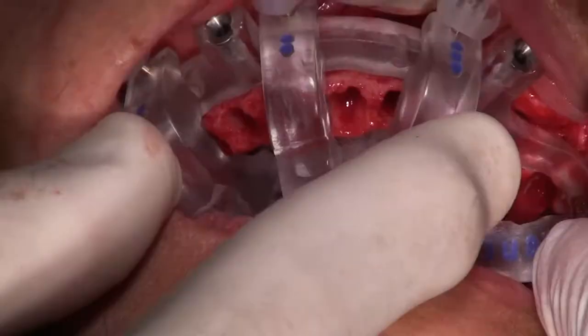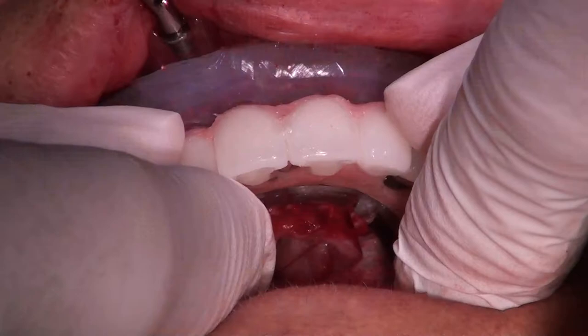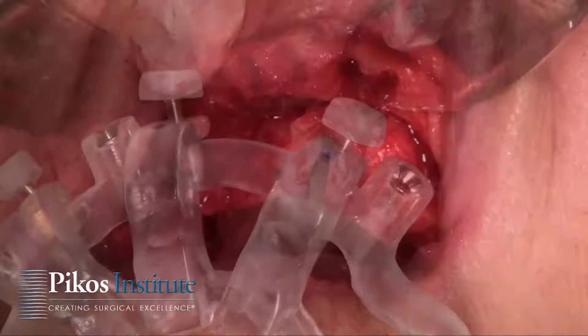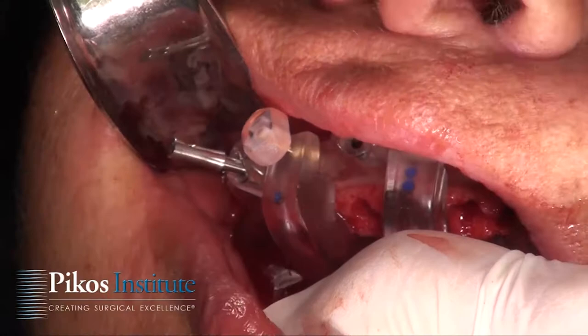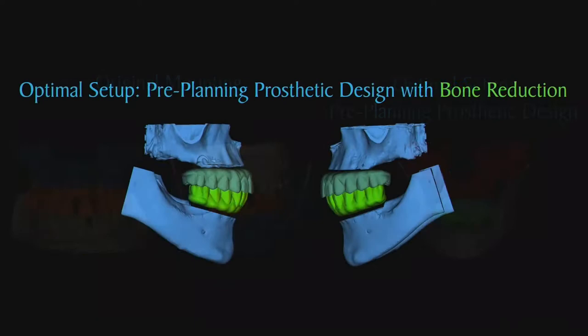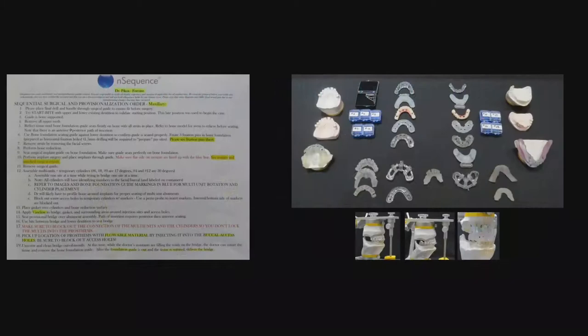I'd like to share a video clip of a typical surgical procedure from our live surgery portion of the full arch immediate reconstruction course at the Institute. This course is unique — there is nothing like it anywhere in the country or the world. We share basic principles and concepts for a protocol that is fully guided full arch reconstruction, not just guided for implant placement but also for placement of a prefabricated PMMA monolithic bar-supported prosthesis — a fixed hybrid prosthesis.